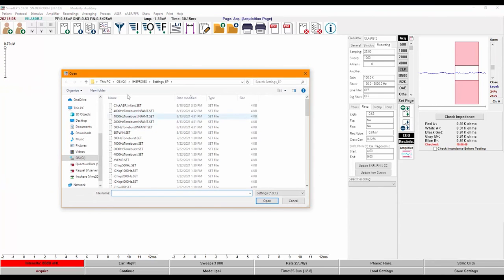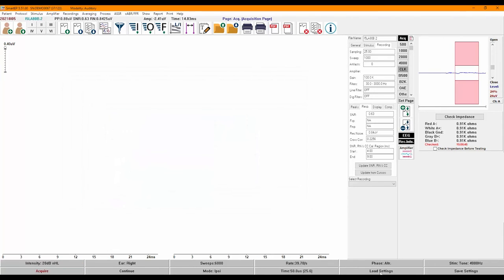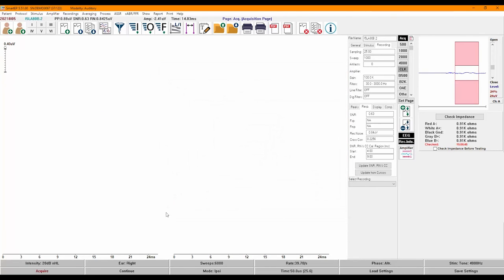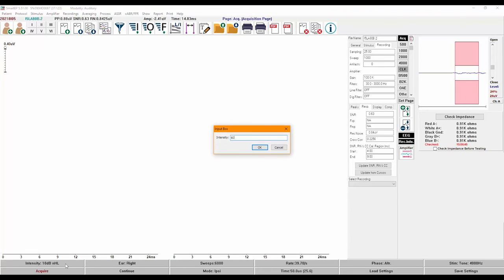I'll go ahead and click on Load Settings and choose my 4000 Hz tone-burst settings. The stimulus is set to be presented continuously and so is set by default to a low intensity. Some clinics start recording at 50 or 60 dB, and others prefer to start at the estimated threshold. To set the intensity, I double-click on the intensity button and enter 60, then begin.